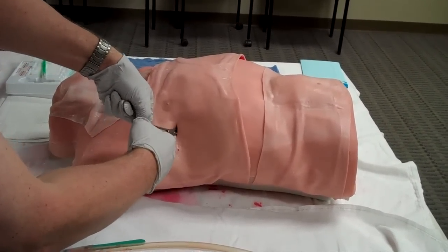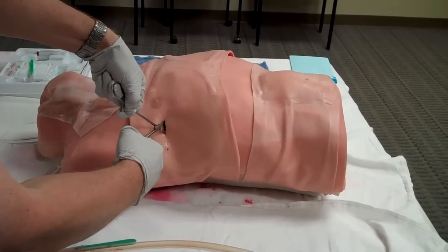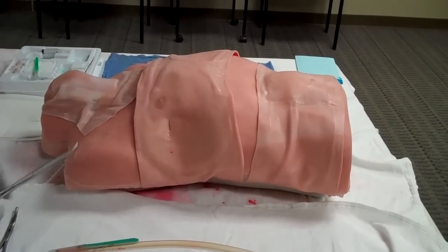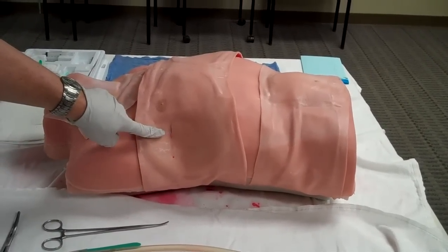And then what you do is you stretch your clamp open to its full extent and pull it straight out of the skin like that. That way it makes sure that your pleural incision is as big as your skin incision.